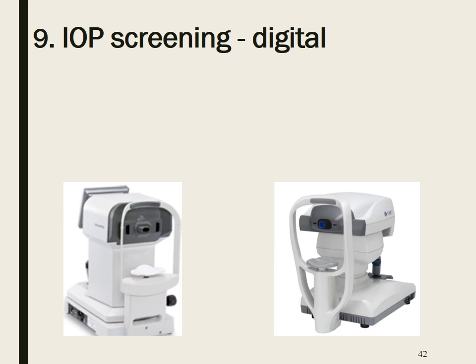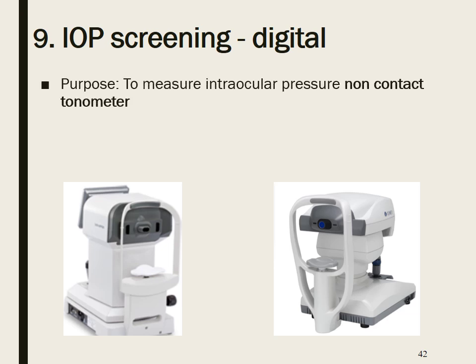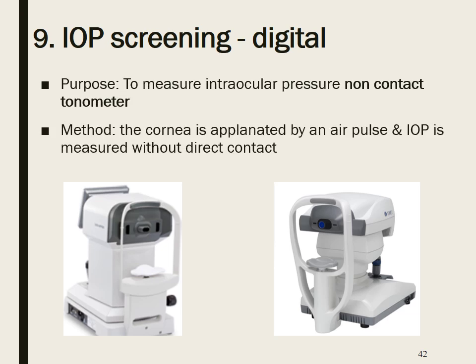This is a non-contact tonometer, which is to measure intraocular pressure. The method used is that the cornea is applanated by an air puff and IOP is measured without direct contact to the cornea. So I will show the demo when we have the lab session next week.